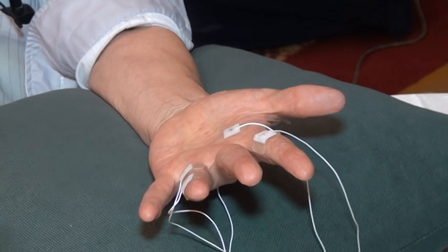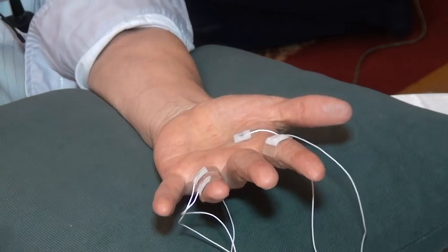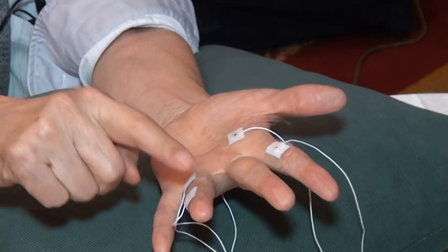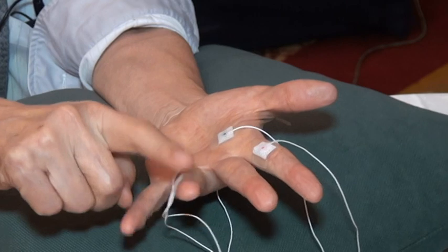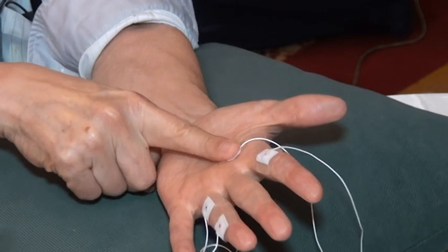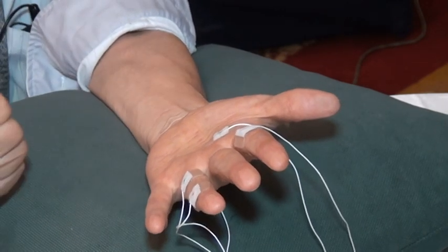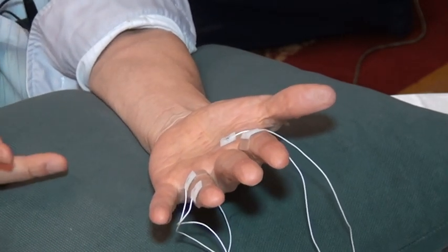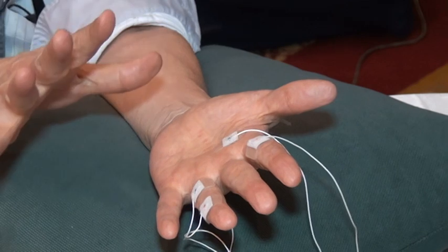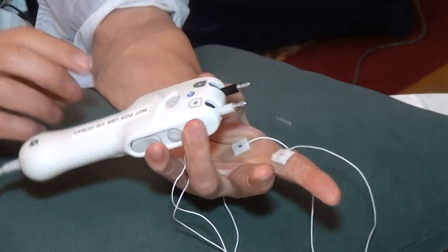In contrast, palmar interossei are all adductors. There are only 3 of them. The first adducts the index, then you skip the middle, the next adducts the ring finger, and the third adducts the little finger. And this electrode, which I press here, is on the second lumbrical and first palmar interosseous, which is ulnar. Therefore, you can now record from both median and ulnar. And we do that too. So this is how it's done.